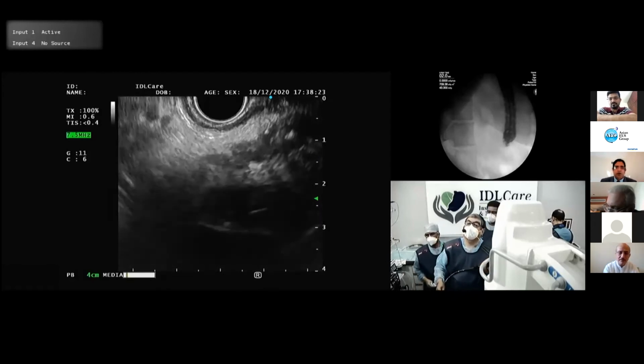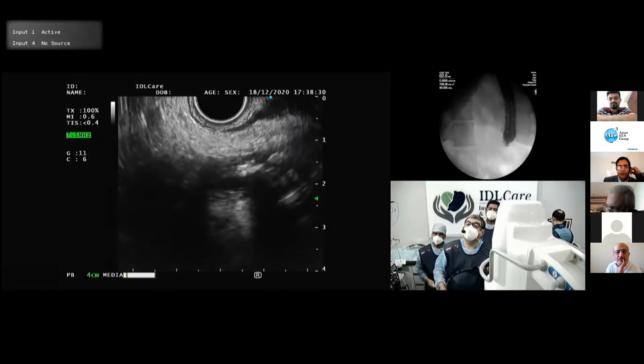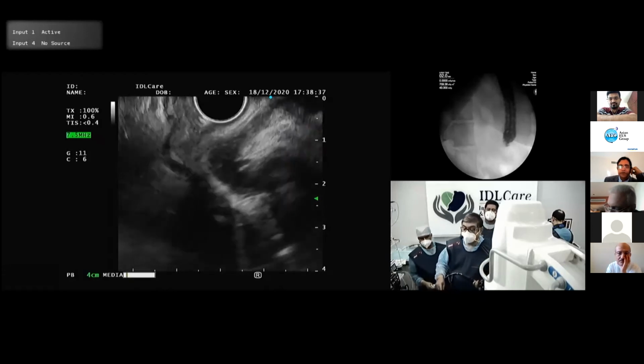You see that? Looks packed, like a total stack. This is the only area where we can puncture and we are not able to puncture. But even if we puncture, we only decompress, probably reduce the pain, that's all.